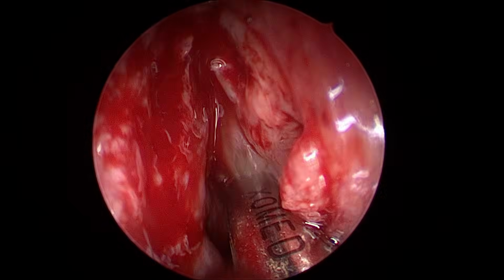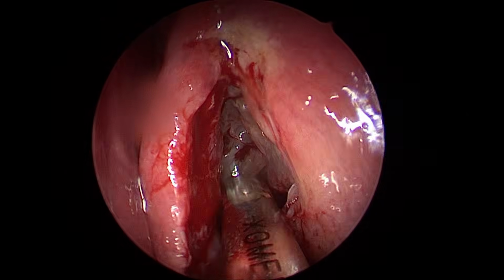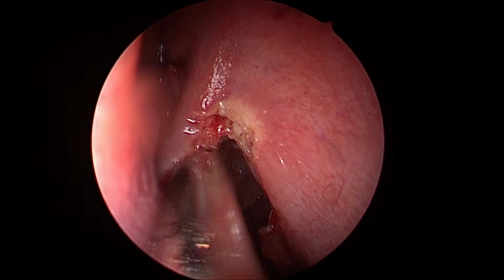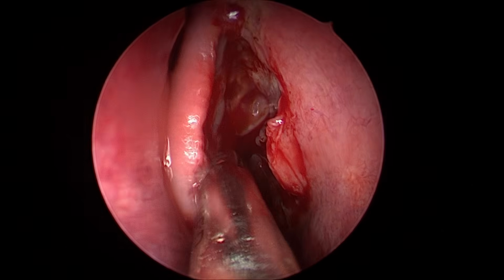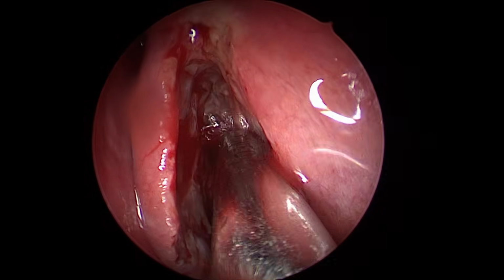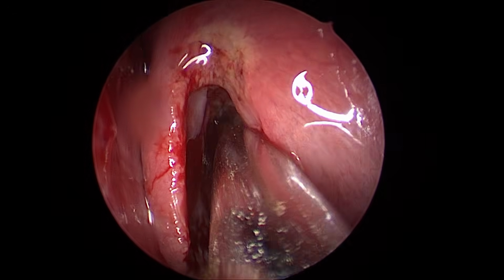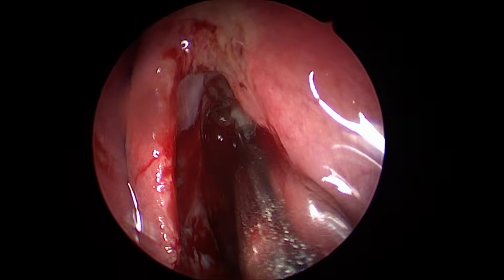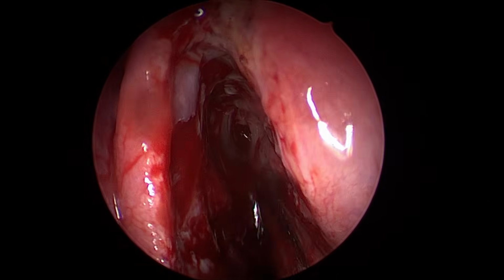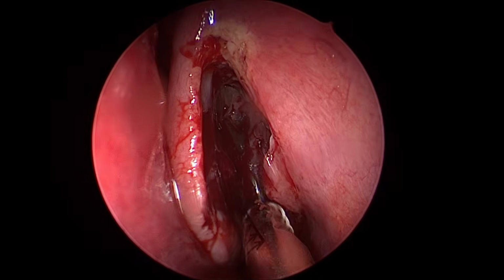See the middle meatus? Polyps, full of polyps. The turbinate is floppy. So we'll do a partial trimming of the turbinate. Whenever there are polyps medial to it, you need to give good access for the steroids to the olfactory region, and you really need to trim the part of the turbinate which comes in the way.